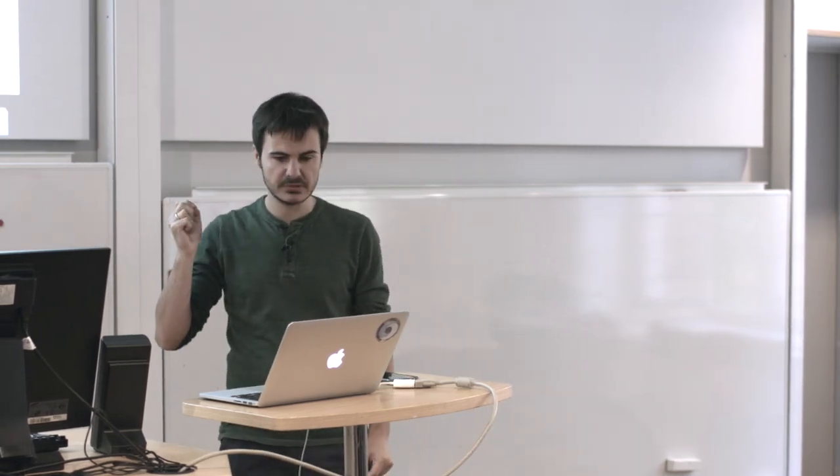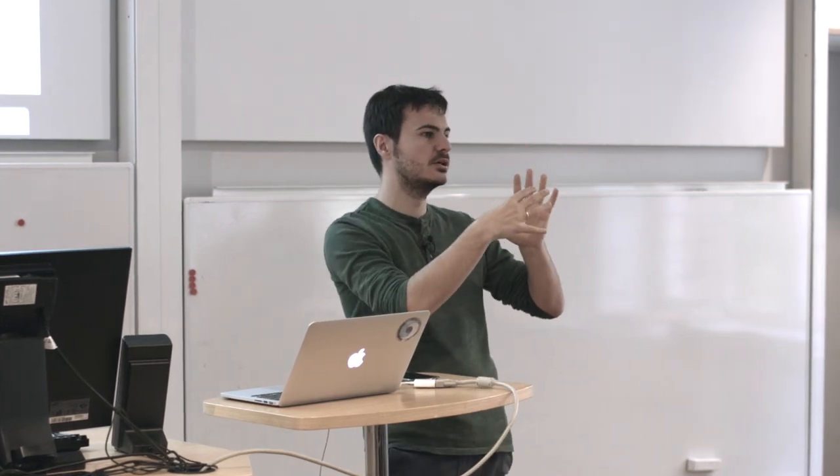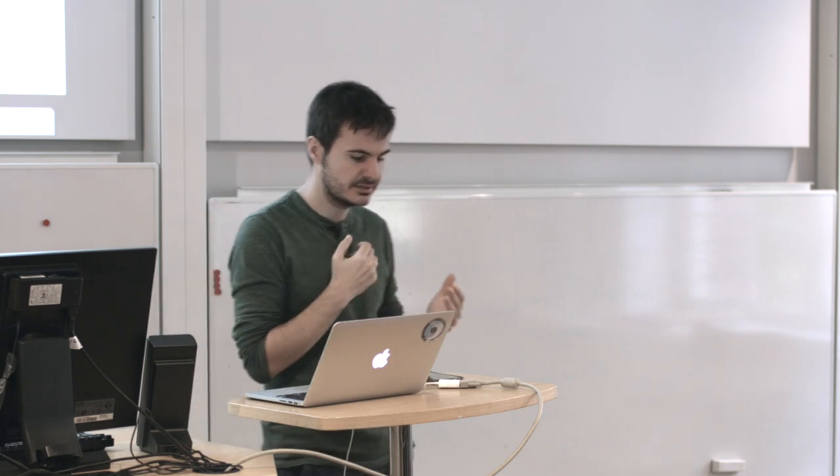Why did you do that instead of just fine tuning? Yeah, so actually we did try fine tuning, but it didn't work as well. But also the main reasoning is that the main differences we see between different scans are usually the texture, small artifacts, and differences in the texture. So these are differences that we thought are learned in the first part of the network, in the first block, and fine tuning is usually good when you do it by the end of the network. By doing it this way, we got quite good results, like the ones we see here. So in the end, that was the best option for us, but that's definitely something we consider.